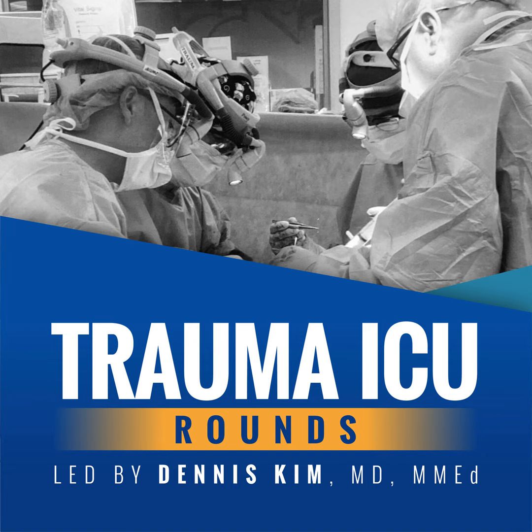Although we do want to monitor their peak pressures, as these can become high if there are changes or increases in resistance or a decrease in lung compliance. Therefore, volume ventilation is the ideal control variable when we wish to achieve or maintain a set CO2 level. And this begs the question, when or why would we ever be interested in maintaining a tight control of CO2?